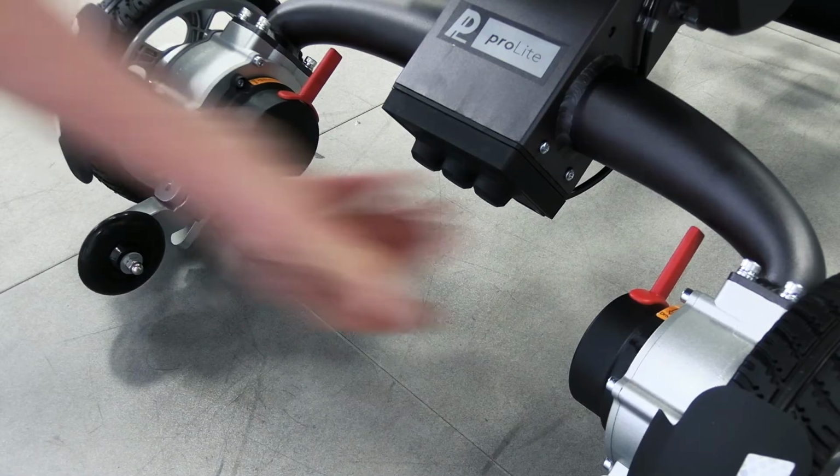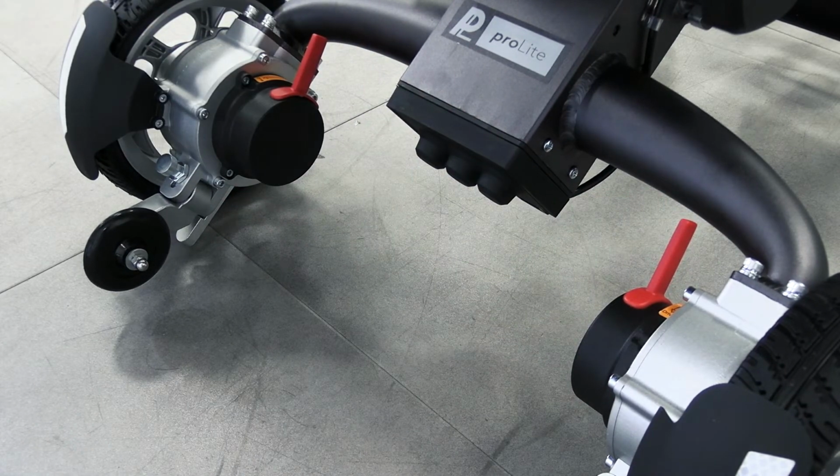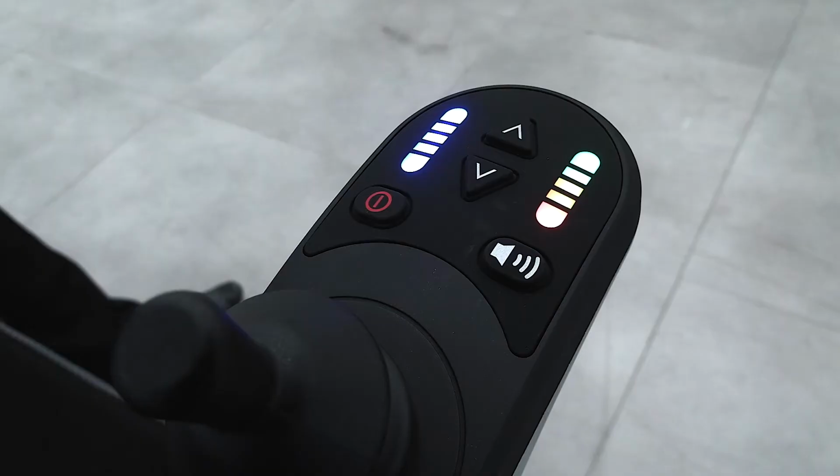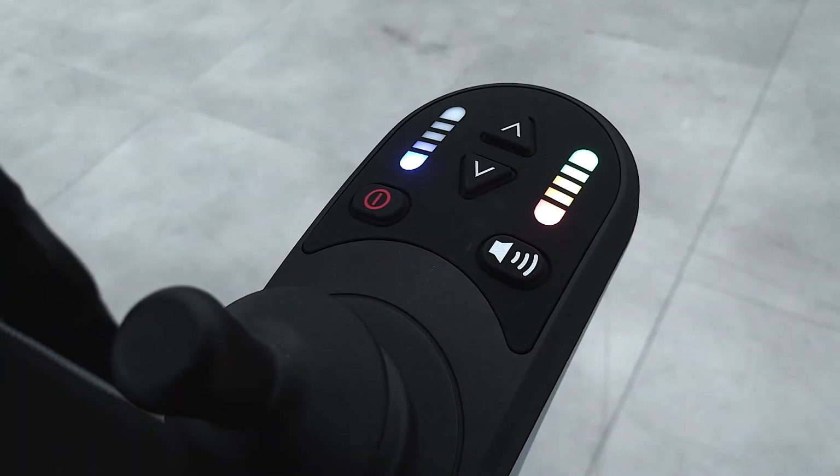The two red levers on the rear of the chair allow you to take the Alluvium from automatic drive to freewheel handling. Ensure these are in the drive mode should you wish to use the chair automatically.